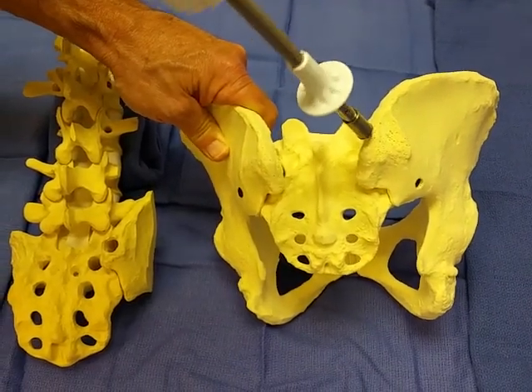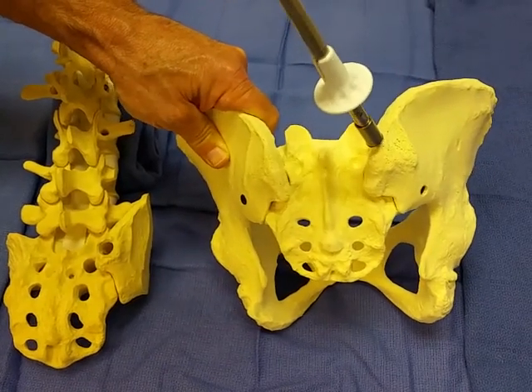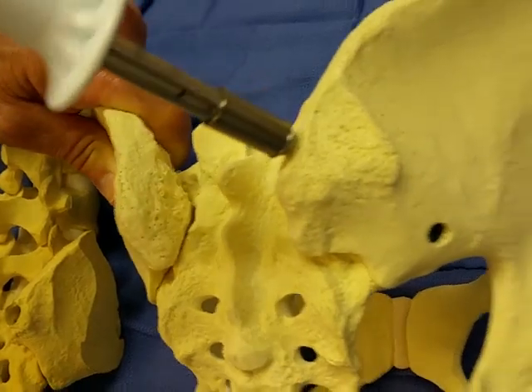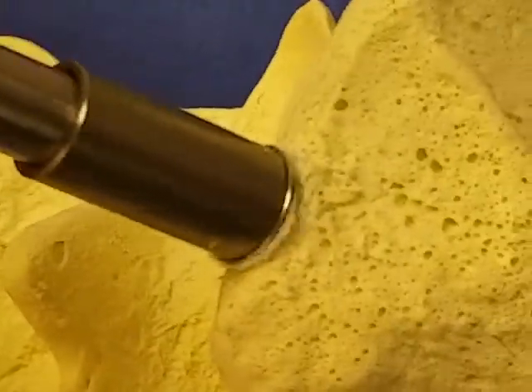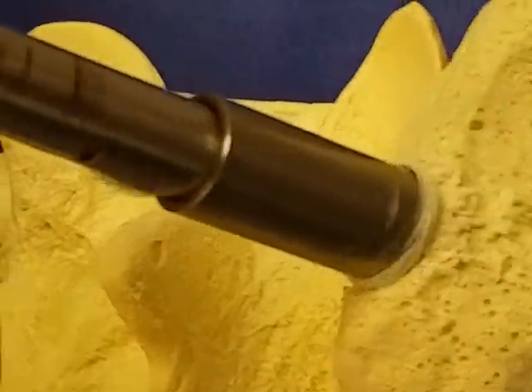It's an oscillating motion with light pressure. Once it gets started it will stay fixed — it's back and forth with more movement in rotation and pressure. This will start shaving the cortical surface. You continue to proceed in that manner until you reach down to the shoulder stop and you'll feel an absence of resistance.